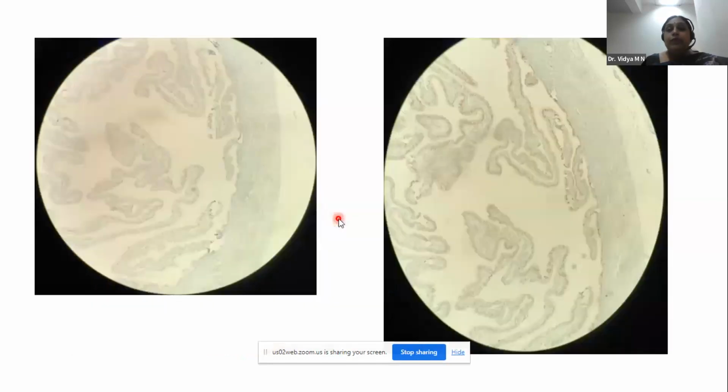So what did we do? We went back to the second step without the amplification with a different kit, and then we increased the antibody incubation time where we did not have any localization seen in the stroma, and it was very specific to the epithelial lining. So this is how you need to know and select your controls as well. Say for example, for this particular case, if I had taken a known positive like a serous carcinoma of the ovary, which generally shows a very strong WT1 staining, if I'd used that strong expressor, I would have got the result in this very first place.